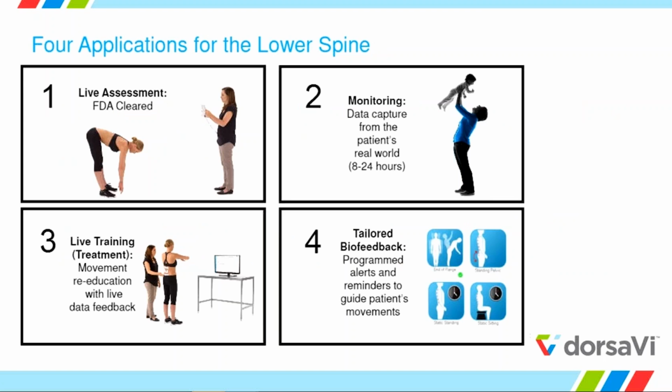So the applications for the lower spine. The first one is the live assessment. The second one is monitoring. We're going to go through all these in detail. The third one is live training. The fourth one is tailored biofeedback.